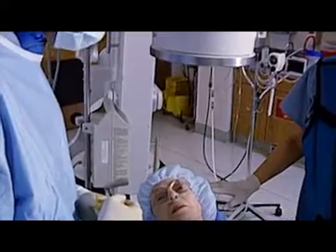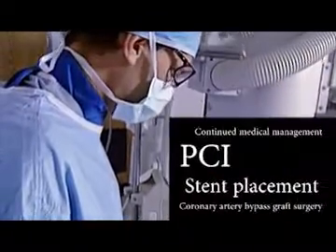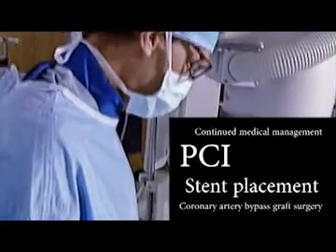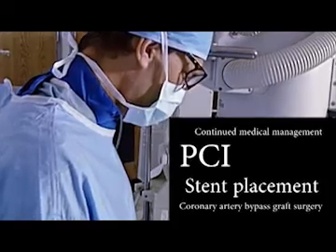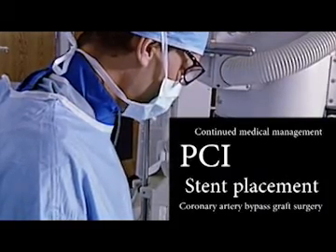Angiograms help the cardiologist determine the best treatment plan for the patient, including continued medical management, PCI or percutaneous coronary intervention, stent placement, or coronary artery bypass graft surgery.